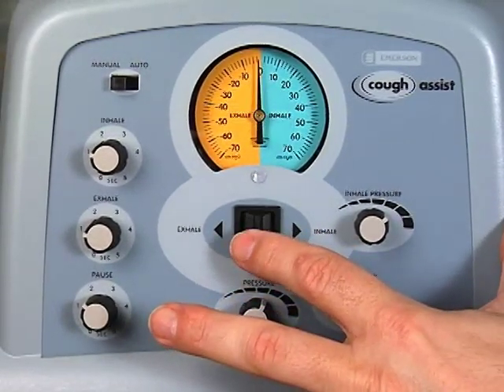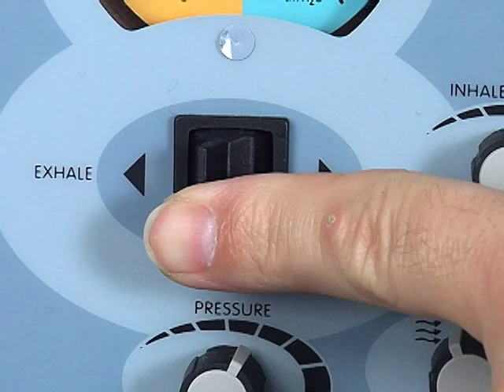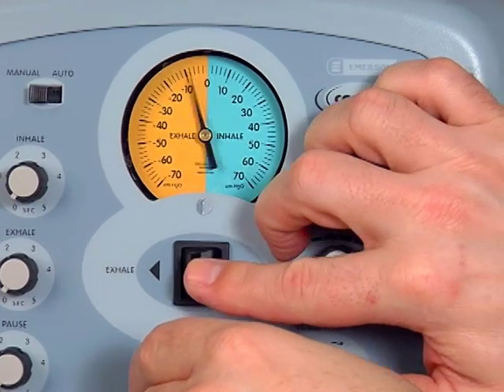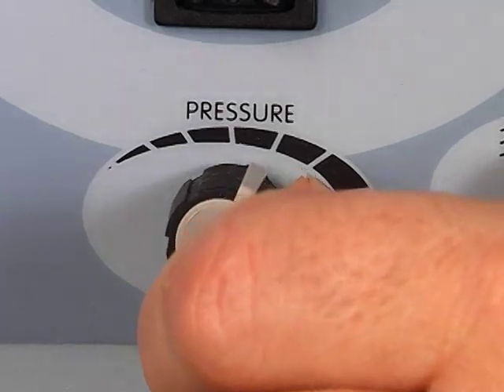First, adjust the expiratory pressure. Push the manual control lever to the exhalation phase — push to the left. Observe the pressure manometer and adjust using the pressure knob. Turn the pressure knob clockwise to increase the pressure and counterclockwise to decrease the pressure.